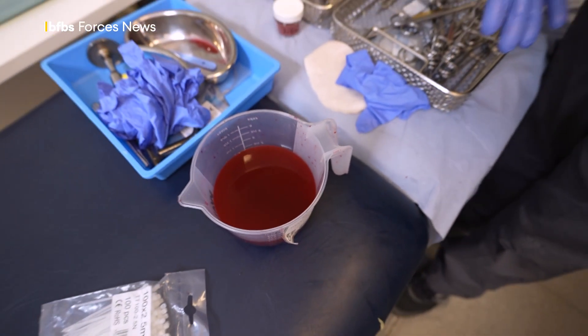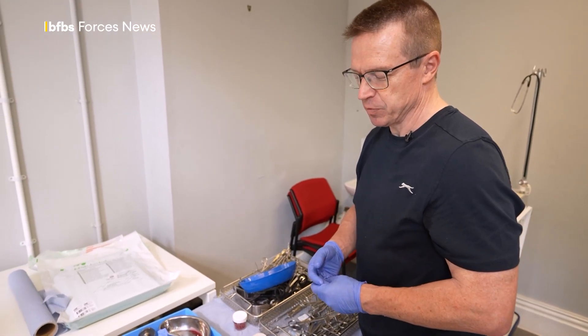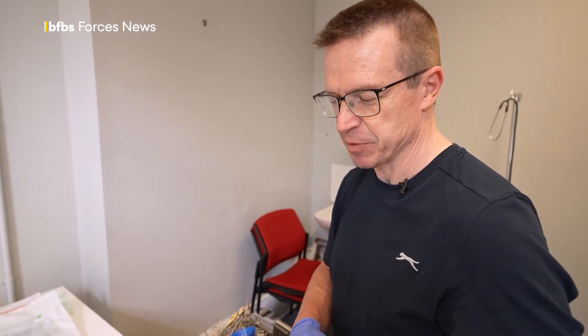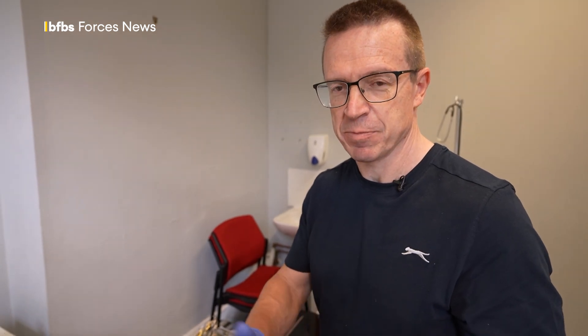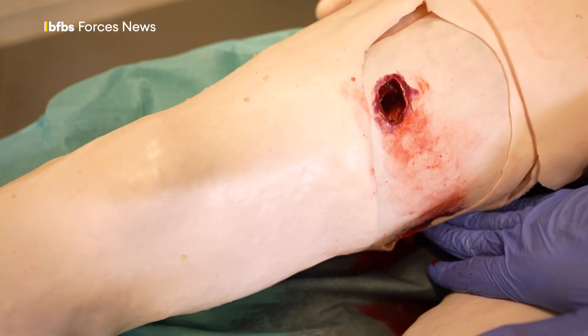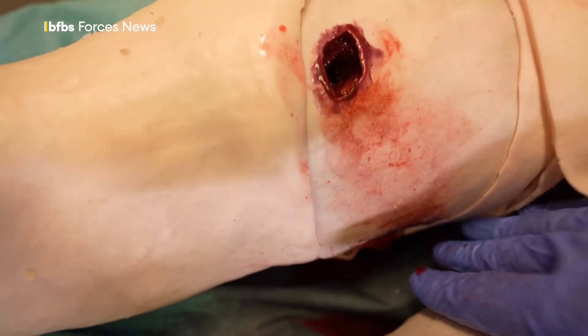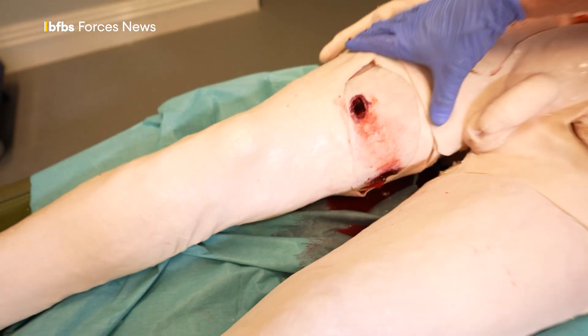Simulated blood is just water with ordinary red food dye in it. When we mix it up at the start of a simulation, we make sure that the water is as warm as possible. The reason for that is the interior of the human body blood is warm, and it just helps the realism, the immersion, the tactile feedback that the surgeons get handling the tissues. You can see the arterial bleeding coming from the wound in the through-and-through gunshot wound, which would be controlled in the practical tomorrow with tourniquets proximal to the wound.